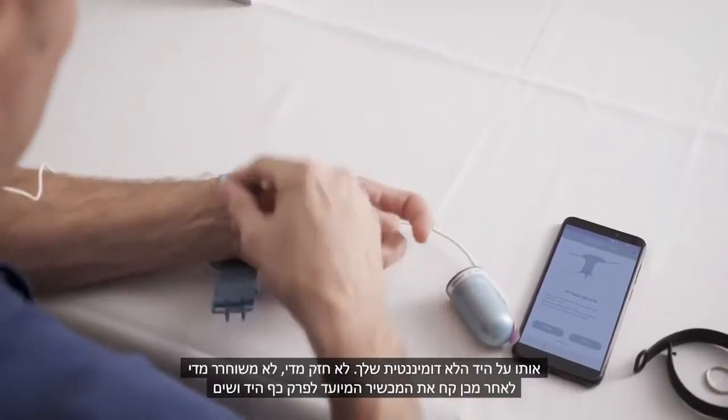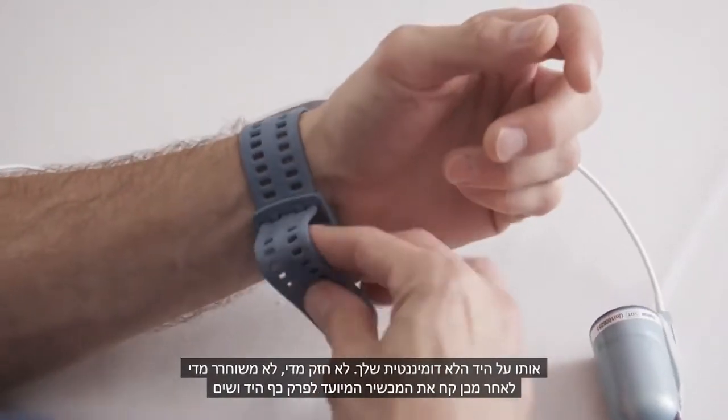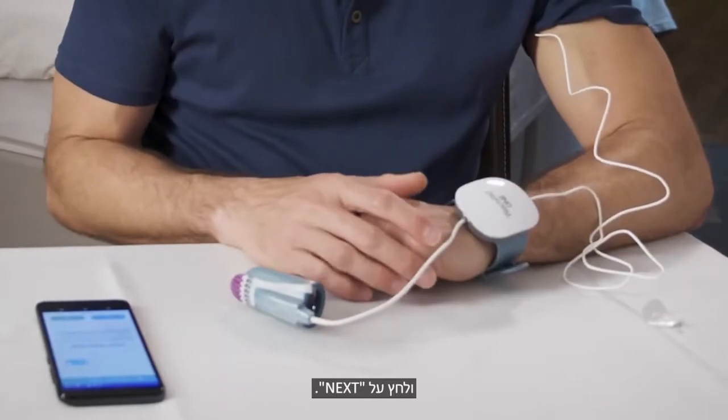Then take the wrist device and strap it on your non-dominant hand — not too tight, not too loose. And press Next.